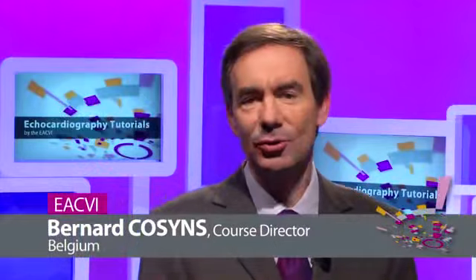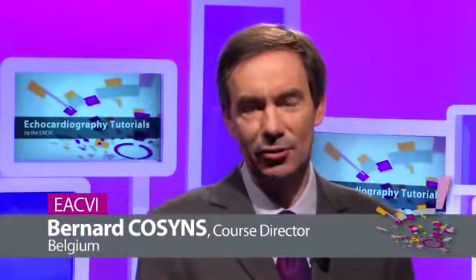So Dr. Moharu will now show how to assess secondary tricuspid regurgitation. This is a kind of tricuspid regurgitation where we cannot find any abnormalities at the level of the leaflets. This is by far the most frequent cause of tricuspid regurgitation. She will now move to the way to assess the severity of this disease and also to look at the consequences of the tricuspid regurgitation on the right ventricular cavities and annulus.